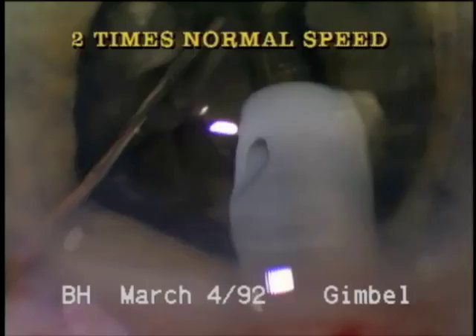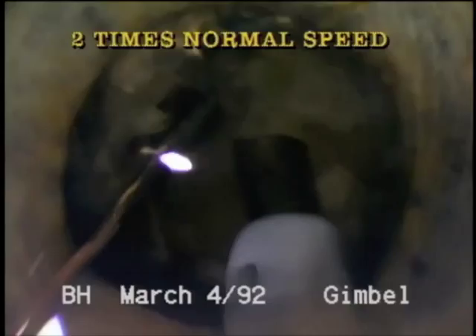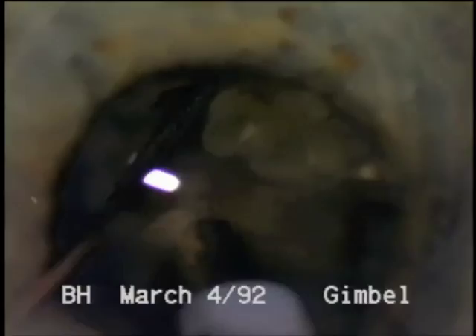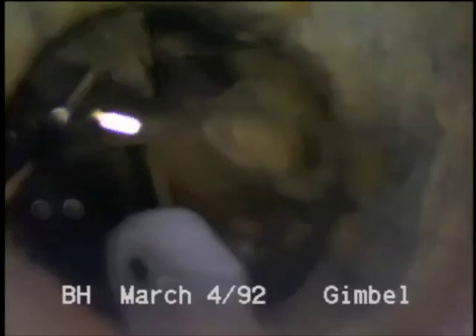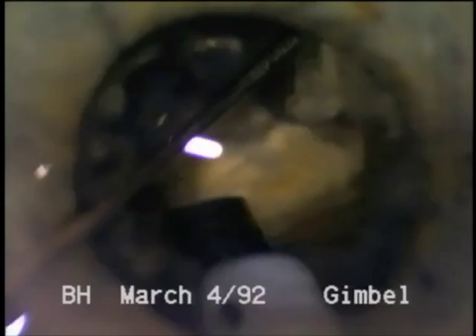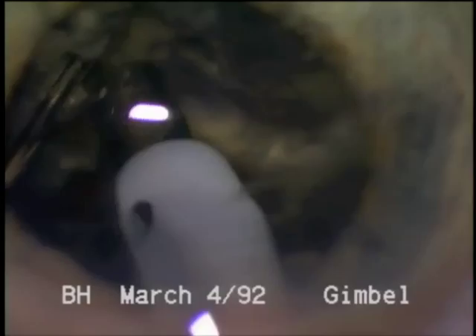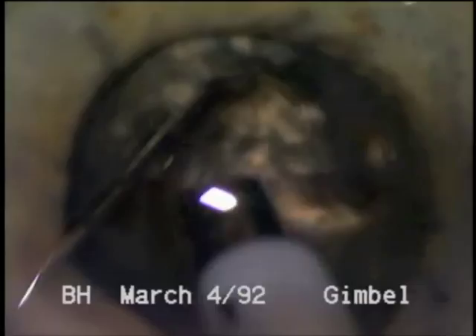We are now showing this at two times normal speed so you can see the entire case in the time allotted. We are trying to thin the posterior portion of the nucleus to get rid of the posterior plate and facilitate fracturing the nuclear rim. If the plate is not removed entirely, the fracturing cannot be complete to the central part of the nucleus. You can see the necessity of the second instrument to rotate, stabilize, and fracture the nucleus.